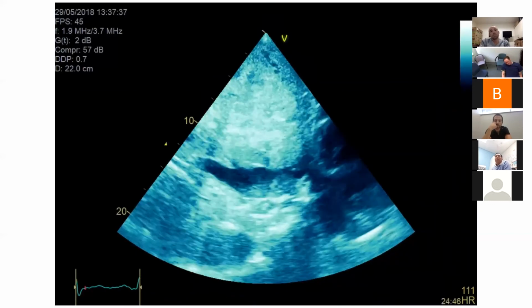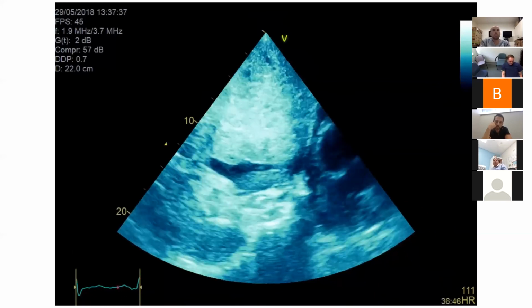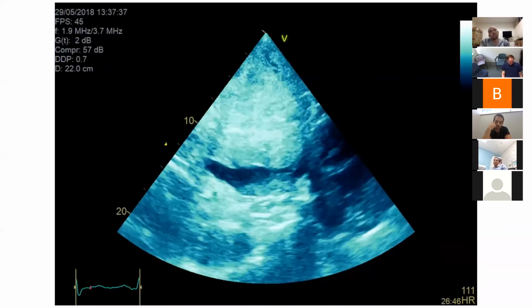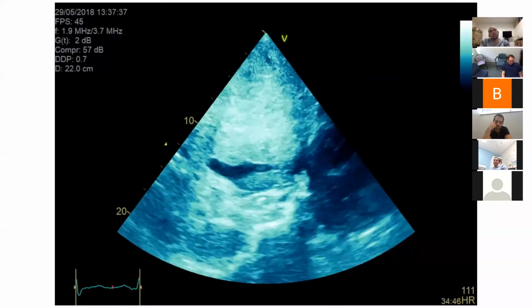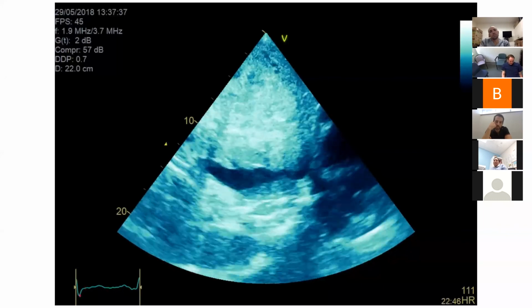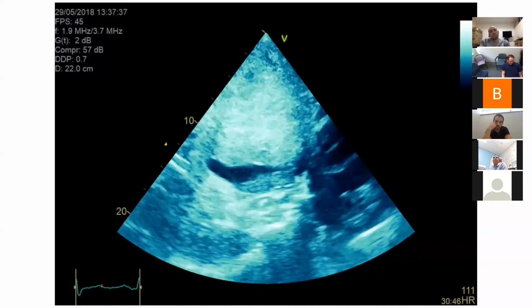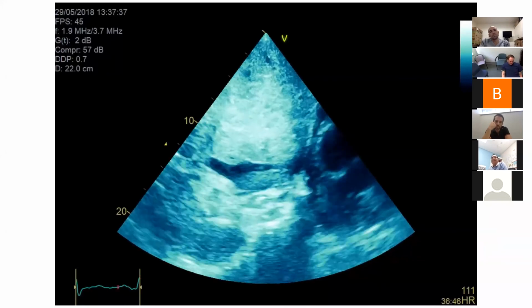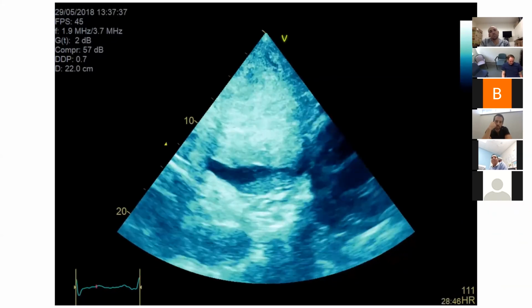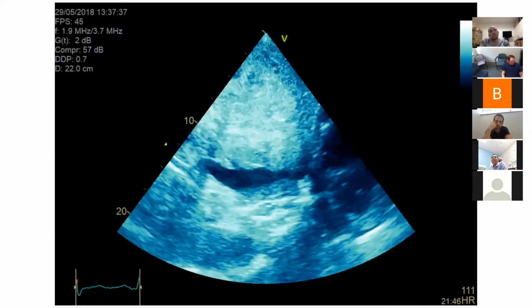Now I didn't get onto that one, but that's what her IVC looked like. You'd like more cardiac cycles, wouldn't you? Again, it's got that heterogeneous appearance to the liver, right? She's got a great big thrombus sitting in her IVC. Yeah, so maybe they did go a bit too far. Who knows? And the liver looks terrible.